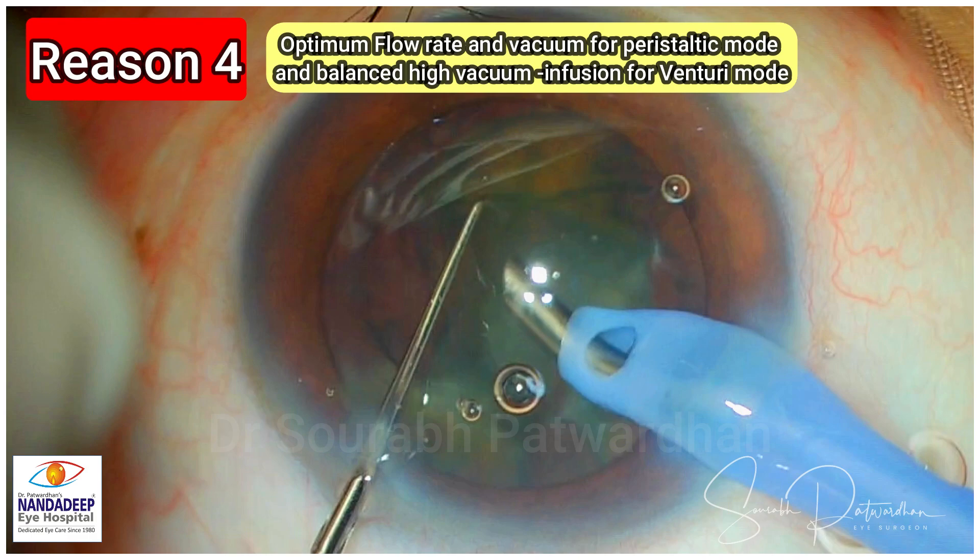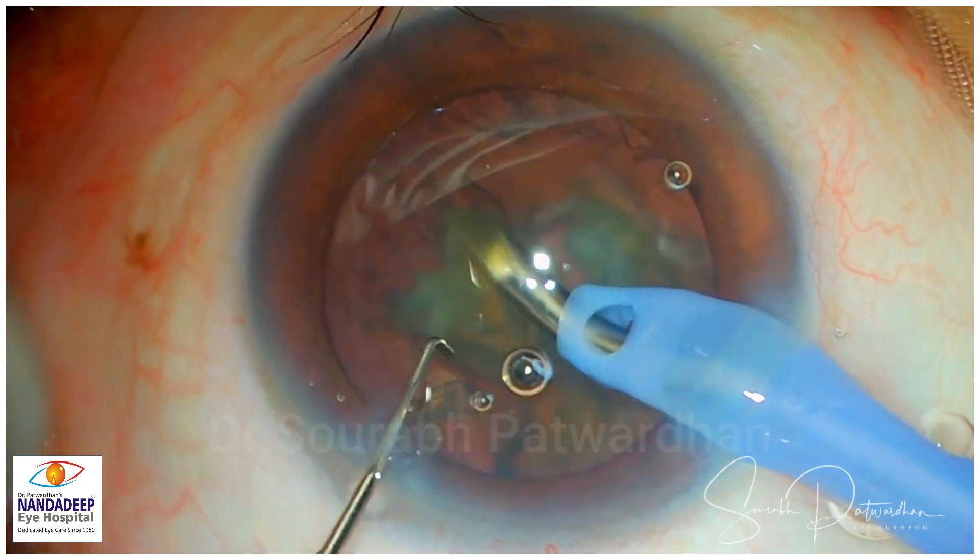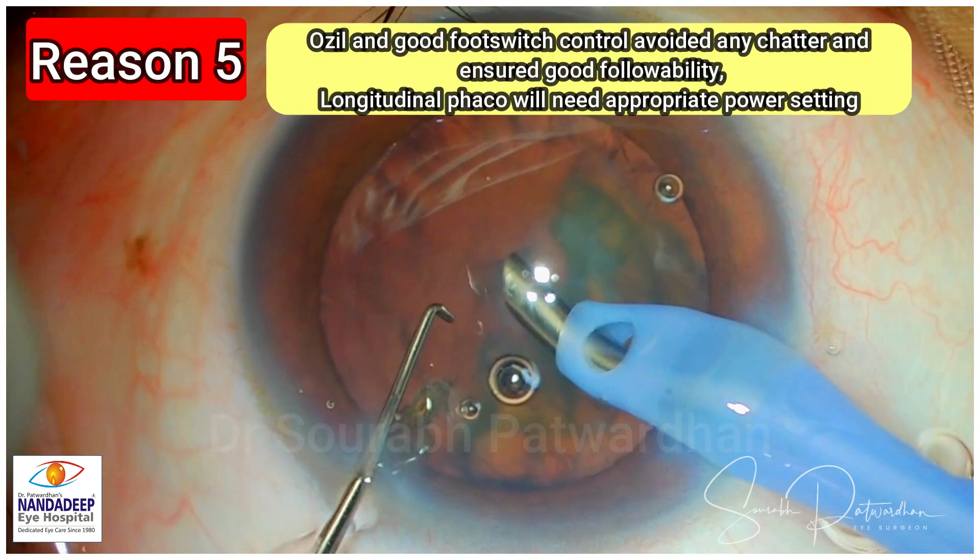Optimum flow rate and vacuum for peristaltic mode, and balanced high vacuum and infusion for venturi mode, are essential for quicker quadrant removal. There has to be a balance between infusion and outflow. Keeping the anterior chamber stable is more important. Ozil and good foot switch control avoided any chatter in this case and ensured good followability.